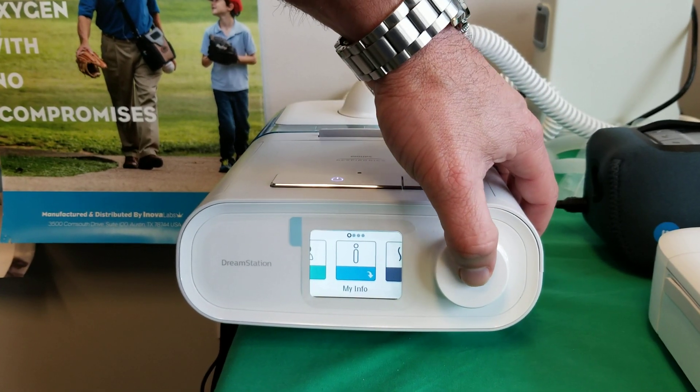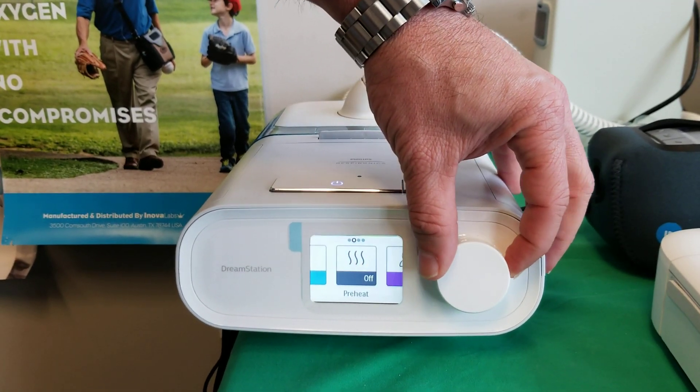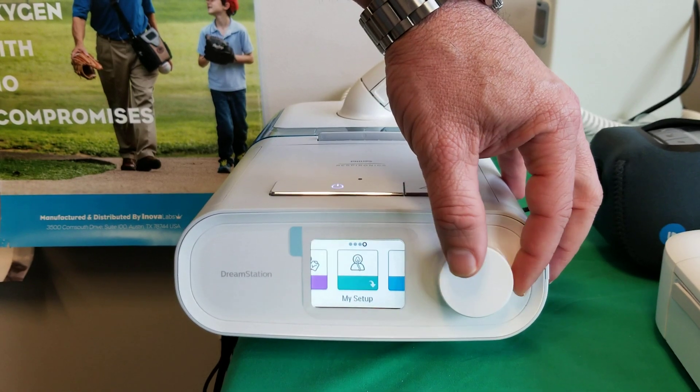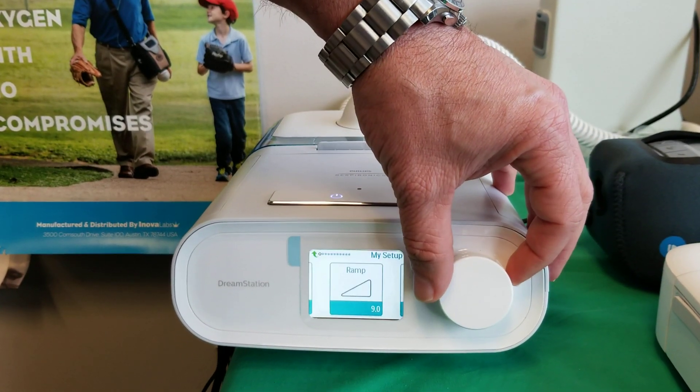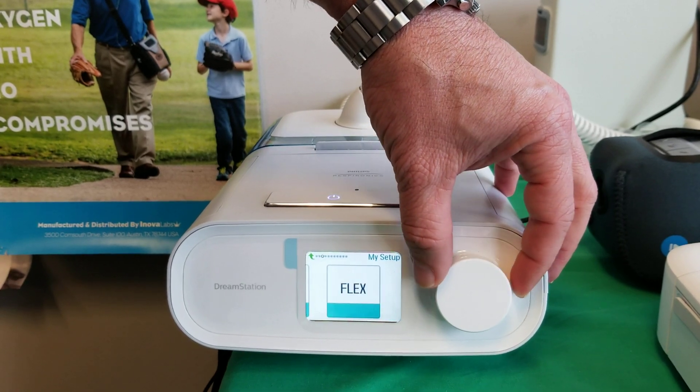So we go to my info on the screen. We're going to scroll over to actually where it says my setup right here. Push the button, enter the menu. We're going to scroll all the way to the right until we see flex.